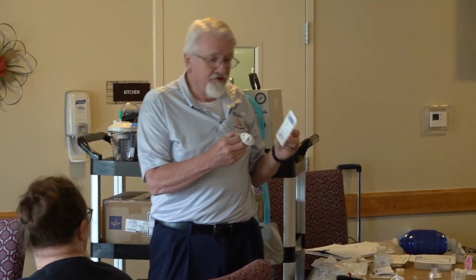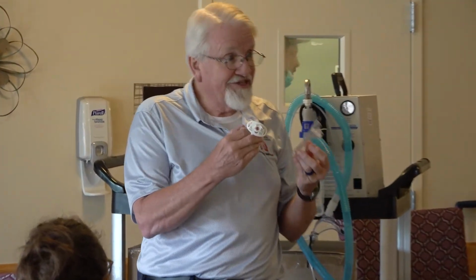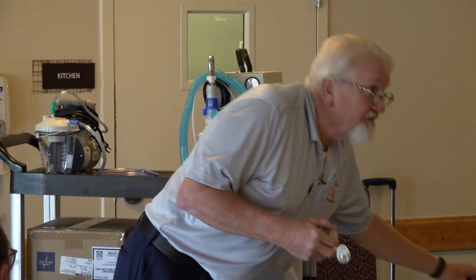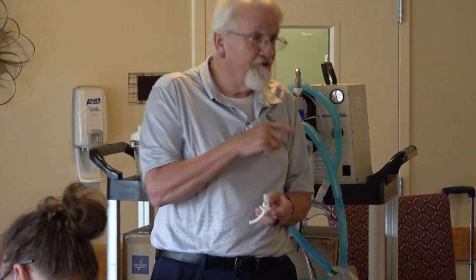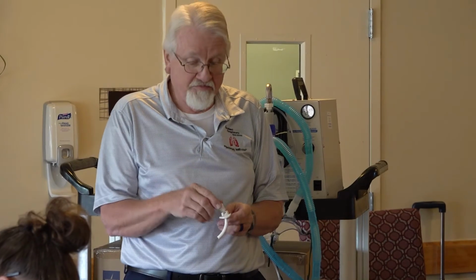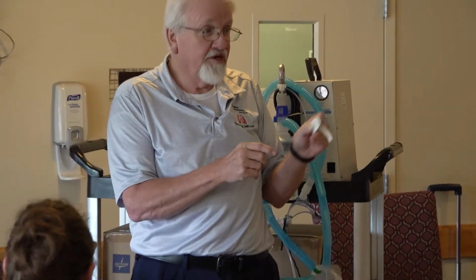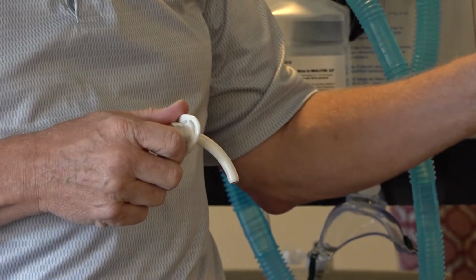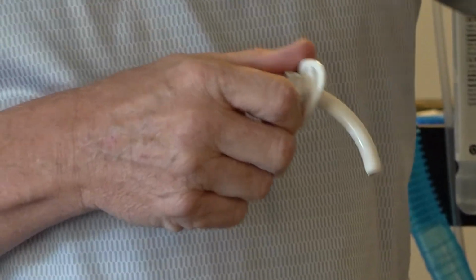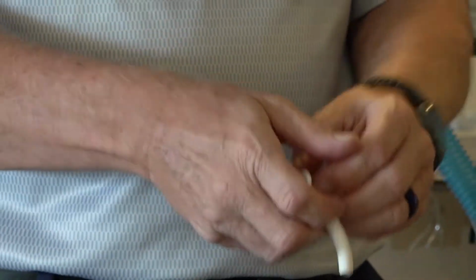The time to do that is, 15 seconds? The time to do that is, depends, 15 minutes, if you don't get called out of the room to go to somebody else's because you're in that room too long. So this is always more convenient, plus it's safer. No chance of cross-contamination, infection, or anything like that, because when you have that inner cannula out, it's a process. You don't do it right, then there's a chance of a complication down the road.